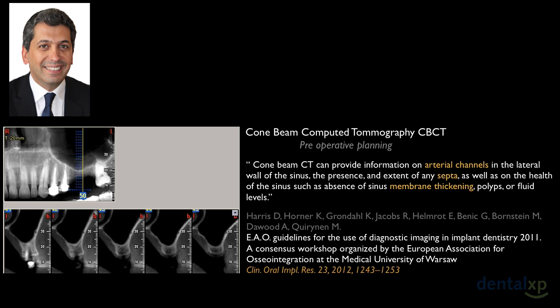One very important step anytime we have to plan our sinus floor elevation is radiographic examination. Since the sinus is a closed cavity that we usually cannot see clinically unless we do an endoscopy, for example, it is very important to use whatever new radiographic techniques can help us detect any abnormalities, pathologies, or anatomic structures inside the sinus.